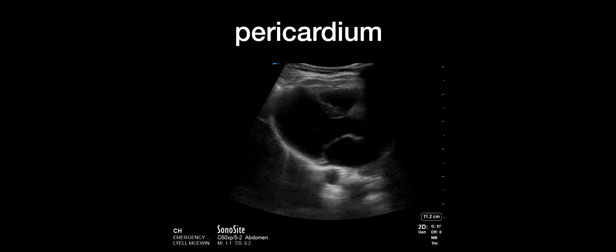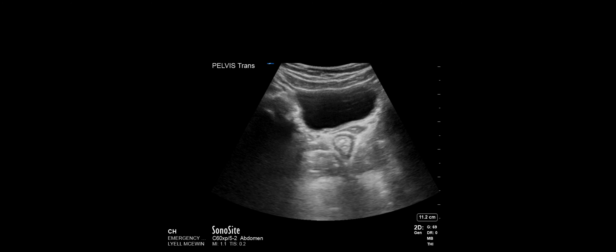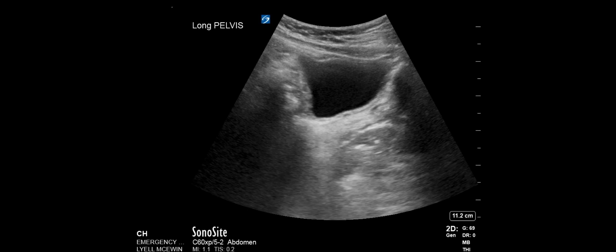Modified to a parasternal long axis view — there's an absence of pericardial effusion. This view is used when we can't get good subcostal views. Looking at the pelvis longitudinally and transversely, there's no free fluid. The key learning point: a negative E-FAST does not equate to no injury. You can still have significant fractures and solid organ injuries that are contained. It gives you a guide to severity and whether early surgical intervention is needed.